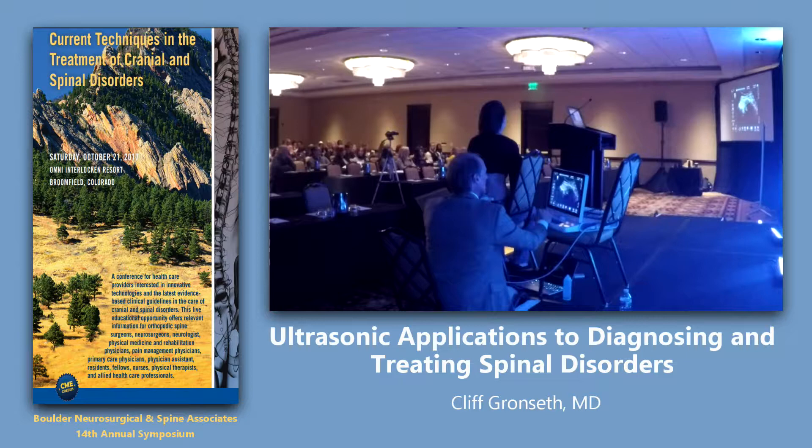If I slide a little bit laterally, you'll see a bone that pops up — that's the iliac bone right there. The SI joint actually sits right where this arrow is. So here's the median crest, here's the intermediate crest, the sacral foramen, and the SI joint is sitting right in this little divot. So if you wanted to do an injection, you can do that with ultrasound guidance — for example, in a pregnant woman needing an SI injection, we can direct a needle directly into the SI joint.